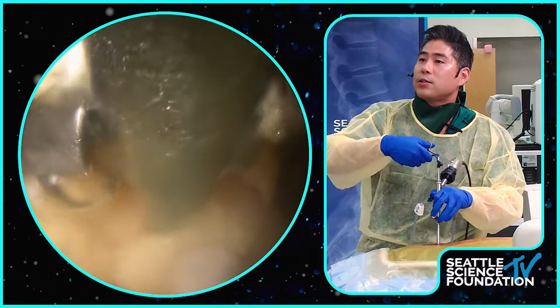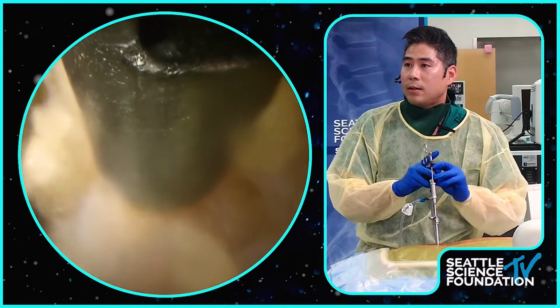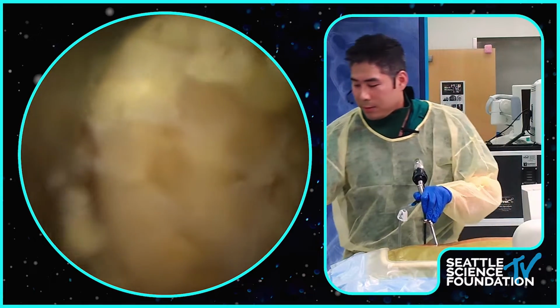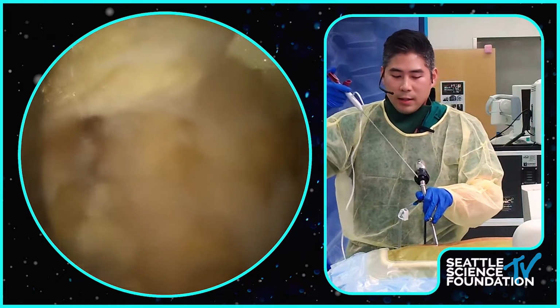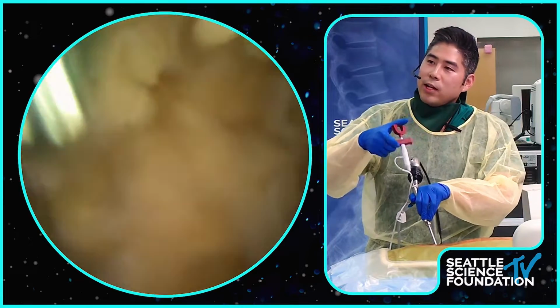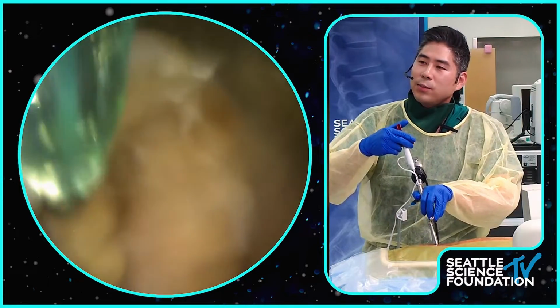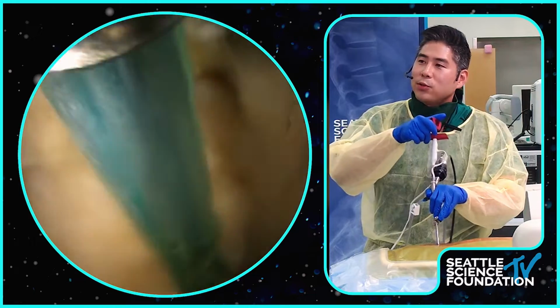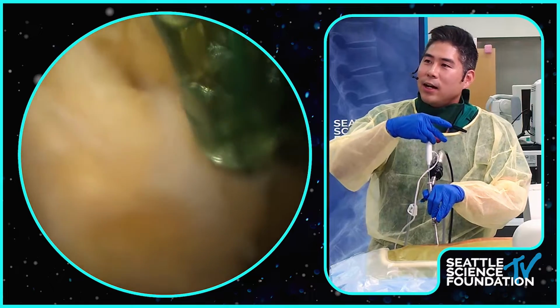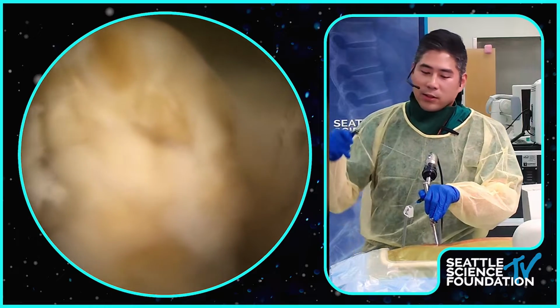This is the punch. A bipolar, please. So John, I know for a lot of the people who are seeing the screen right now, it's very difficult for us to make out what you're seeing, but I think what you highlighted is that it is a lot of feel in the beginning, right? It is a lot of feel. I think as you get used to it, and the cadaver look is a little bit more difficult. Definitely the color looks different. So in the beginning, you're going to see a lot of red muscles, and as you clean up this fat and things like that, you're going to see the yellow ligament is a very distinct color. It appears very starkly different from the rest of the tissue.